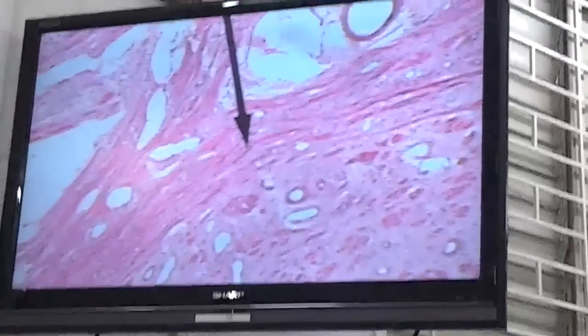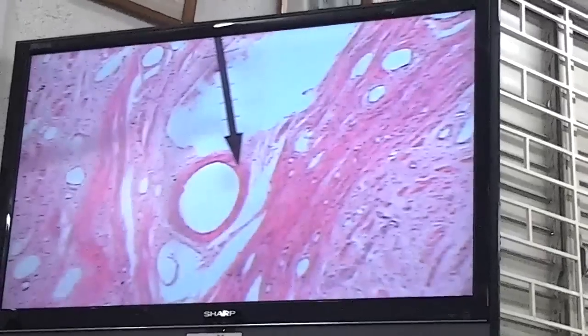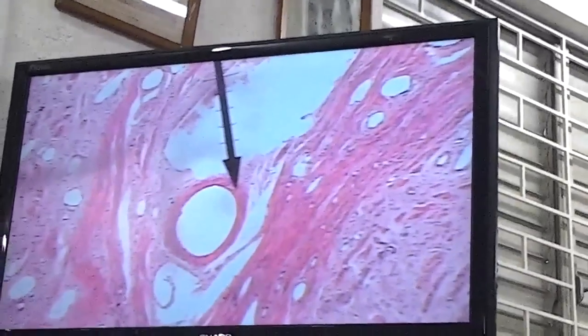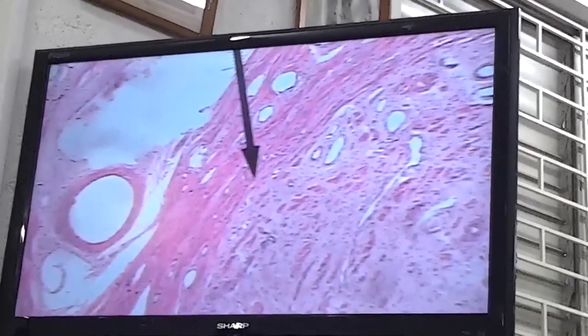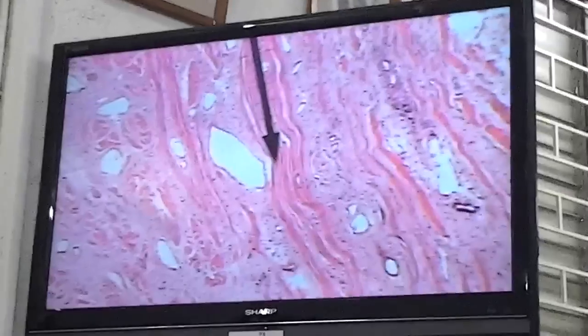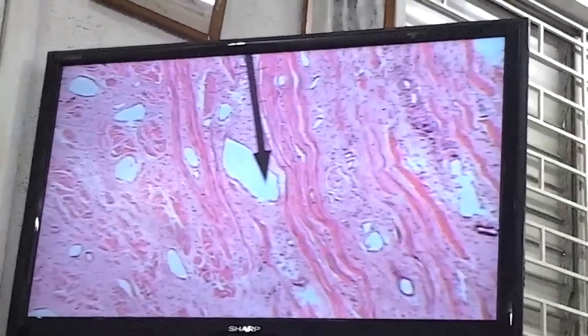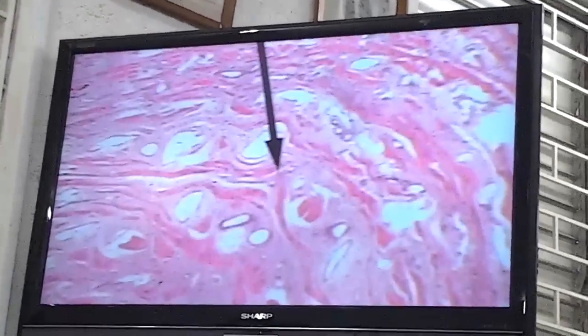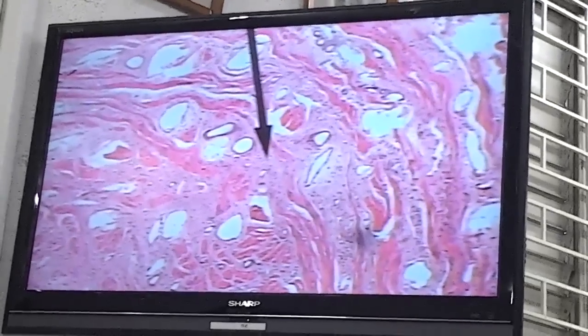You can see this is very vascular around here, with a lot of blood vessels. There is a well-developed plexus vasculature around the wall of the vagina. The vagina has a smooth muscle wall, and here you can see the smooth muscle wall of the vagina. There are a lot of venous sinusoidal spaces. Look at that. All of this can become filled with blood.